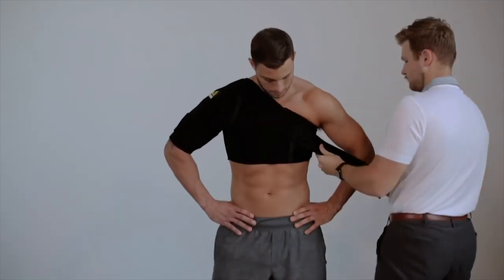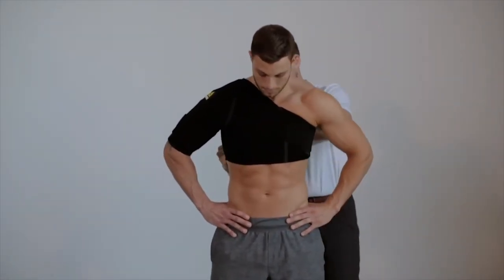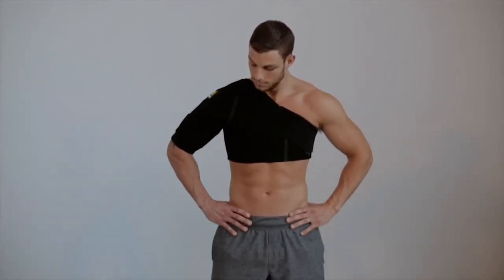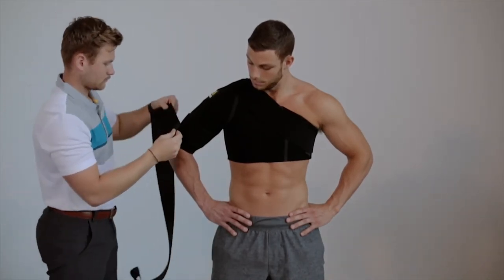Bring Strap A across the chest, around to the back. Cut the strap to length and secure with hook and loop closure. For Strap B, attach the fixed hook and loop end of the second strap to the medial and anterior aspect of the arm.